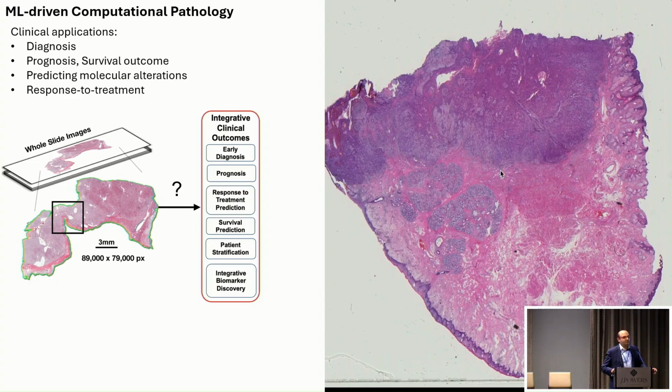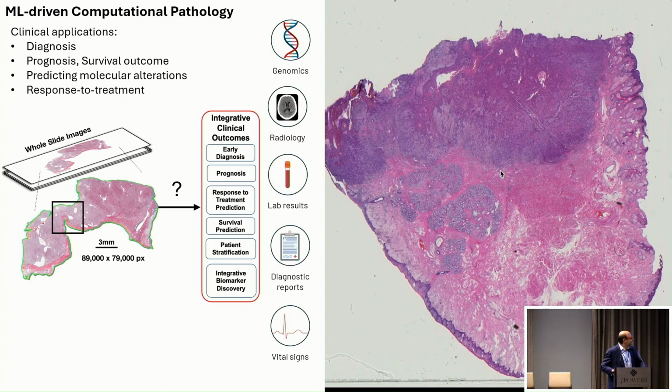So discovering from those kinds of data was digital to begin with, but the standard of care largely around the country and effectively around the world still remains looking at a glass slide under a microscope. So machine learning offers a really good opportunity to analyze some of this data.